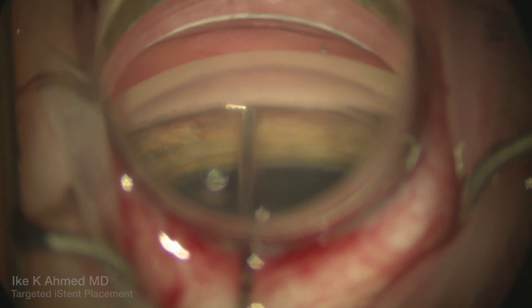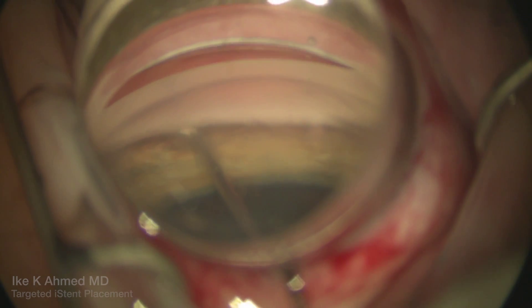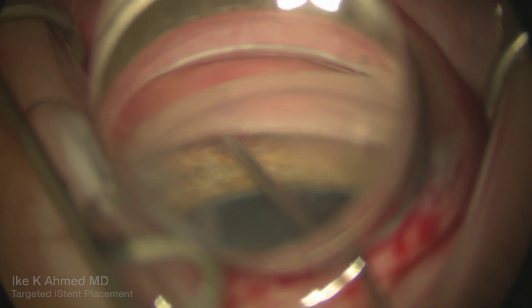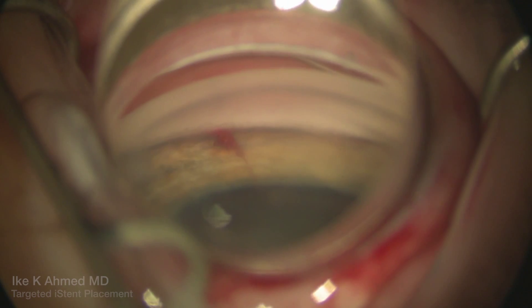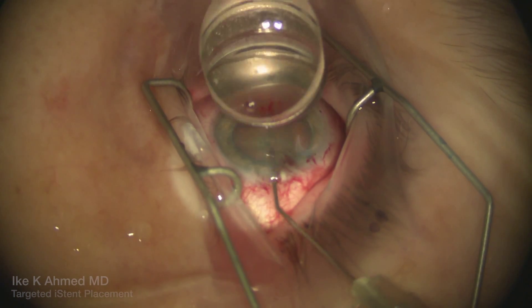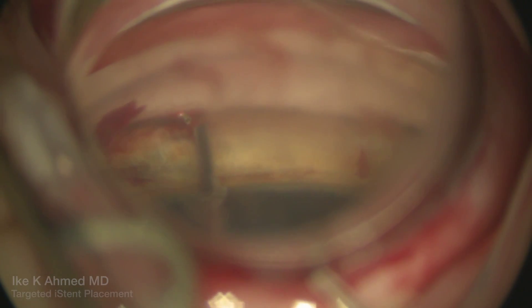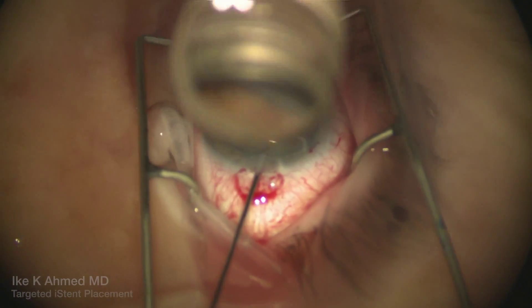Our iStents are being placed here. We're placing three iStents in the areas which were previously marked. The first iStent goes in, and some immediate blood reflux is present — a positive sign indicating we're likely in the area of the aqueous vein ostium. It's placed right under that mark indicating where we want it to be.